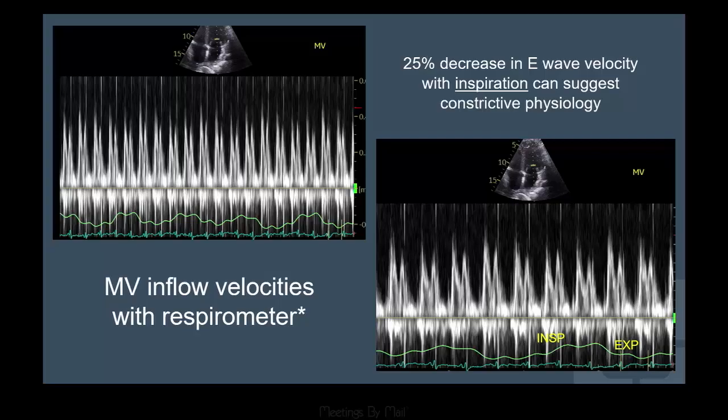That was wonderful. I was going to mention that, Dr. Klein. I think, for a technical tip for sonographers in the crowd, yes, these can be challenging, and it seems like it should be simpler than it is. But respirometer studies can be challenging, and one of the things that I instruct our sonographers to do is take that box part of the EKG, whichever vendor you're using, and lay it on the patient instead.